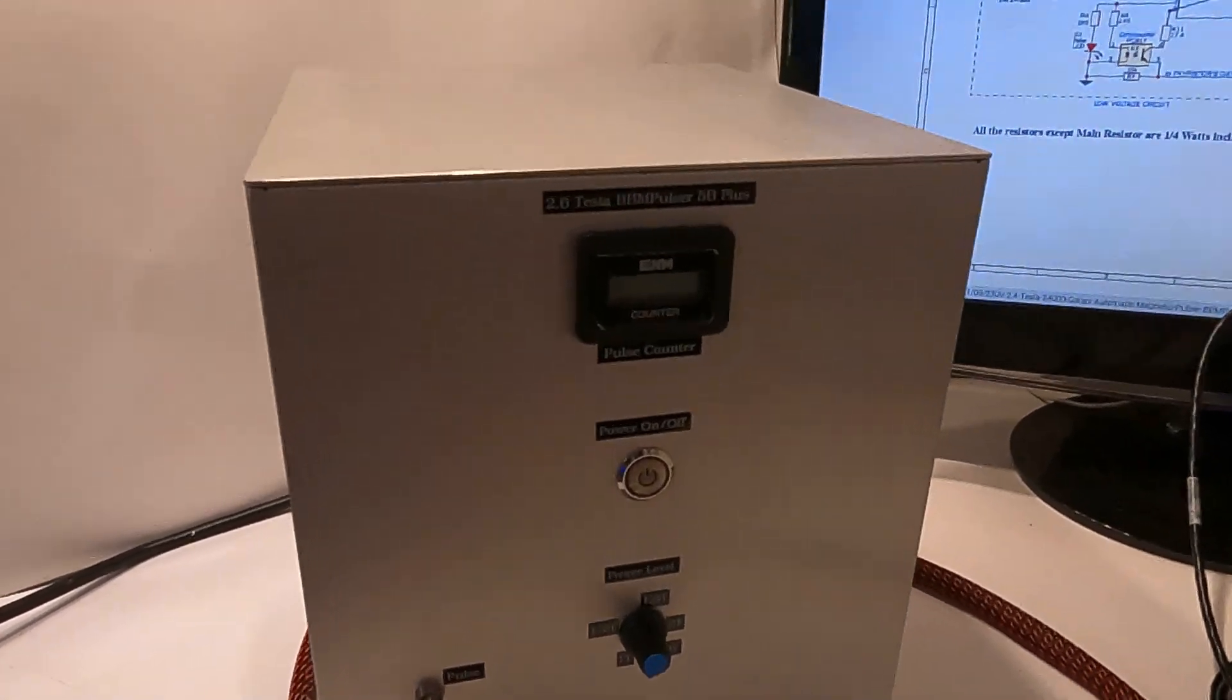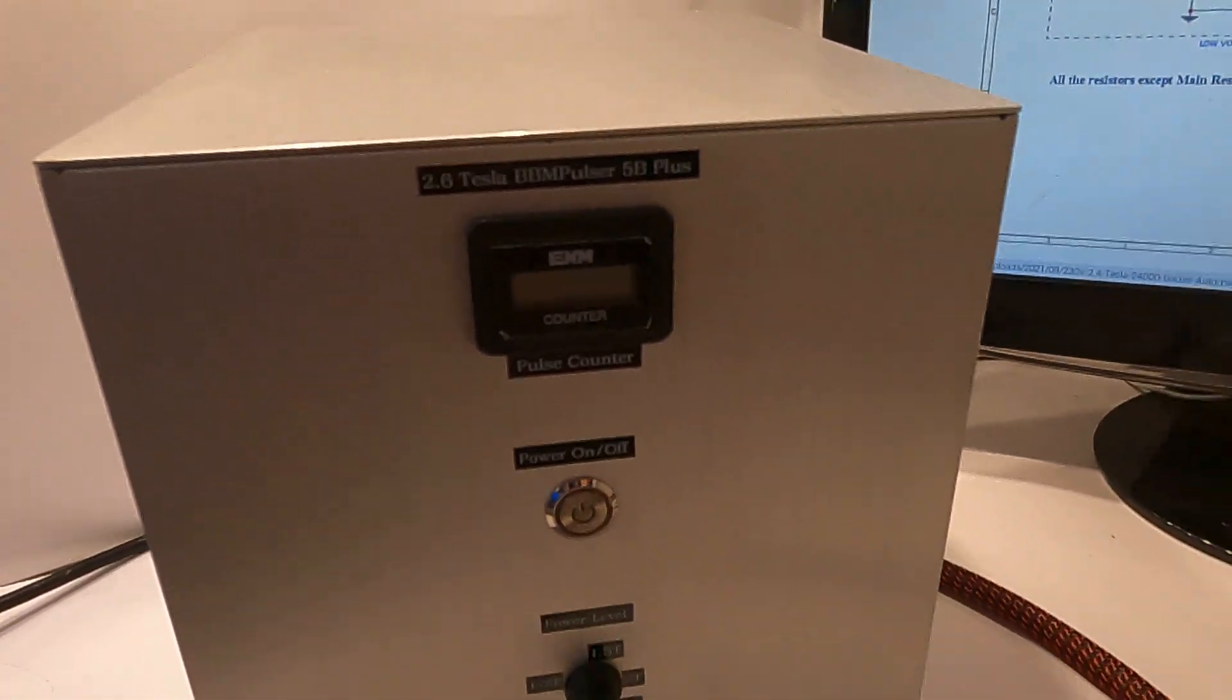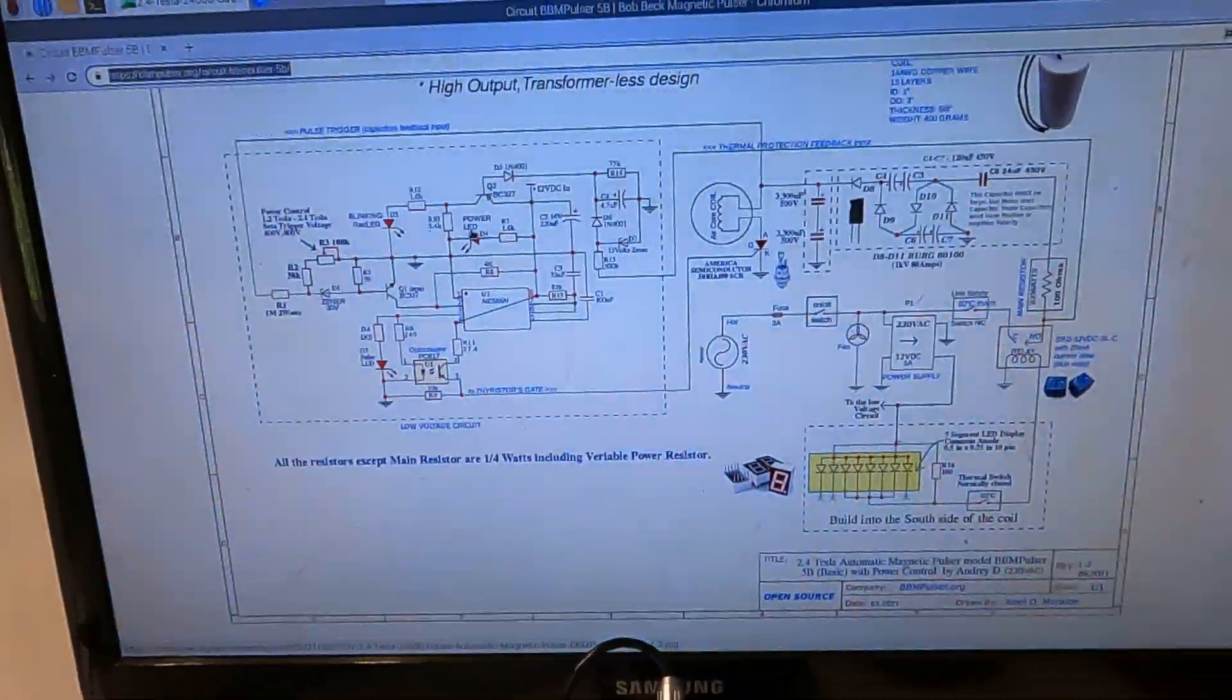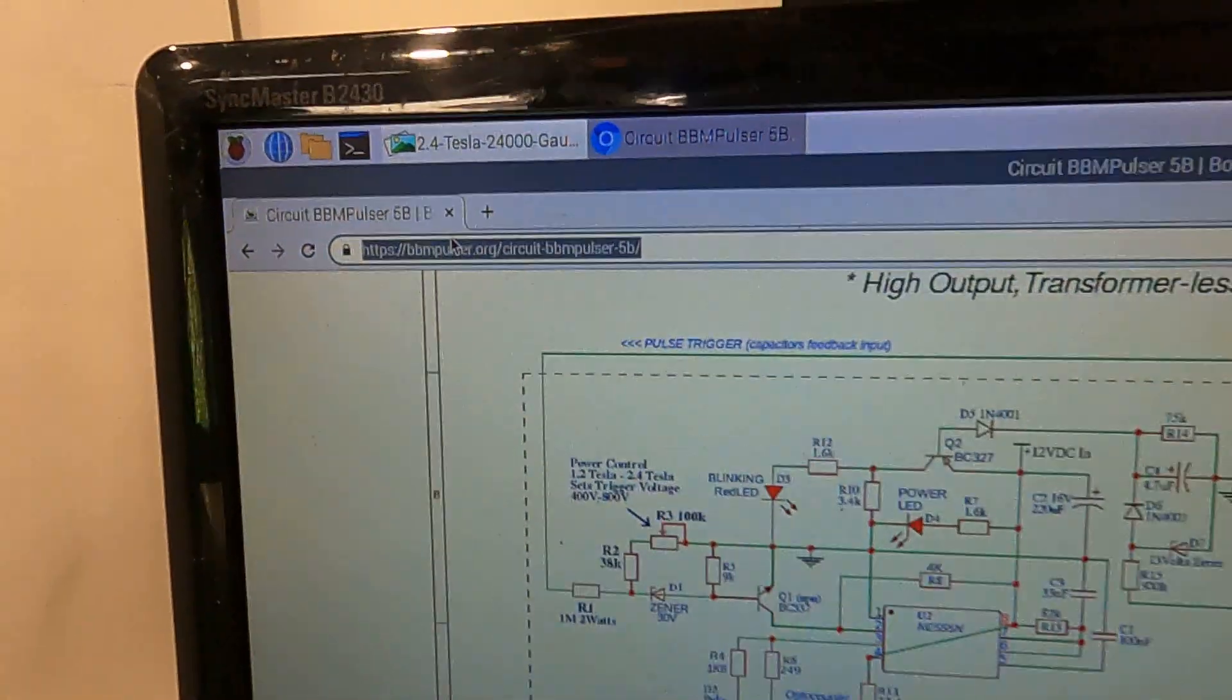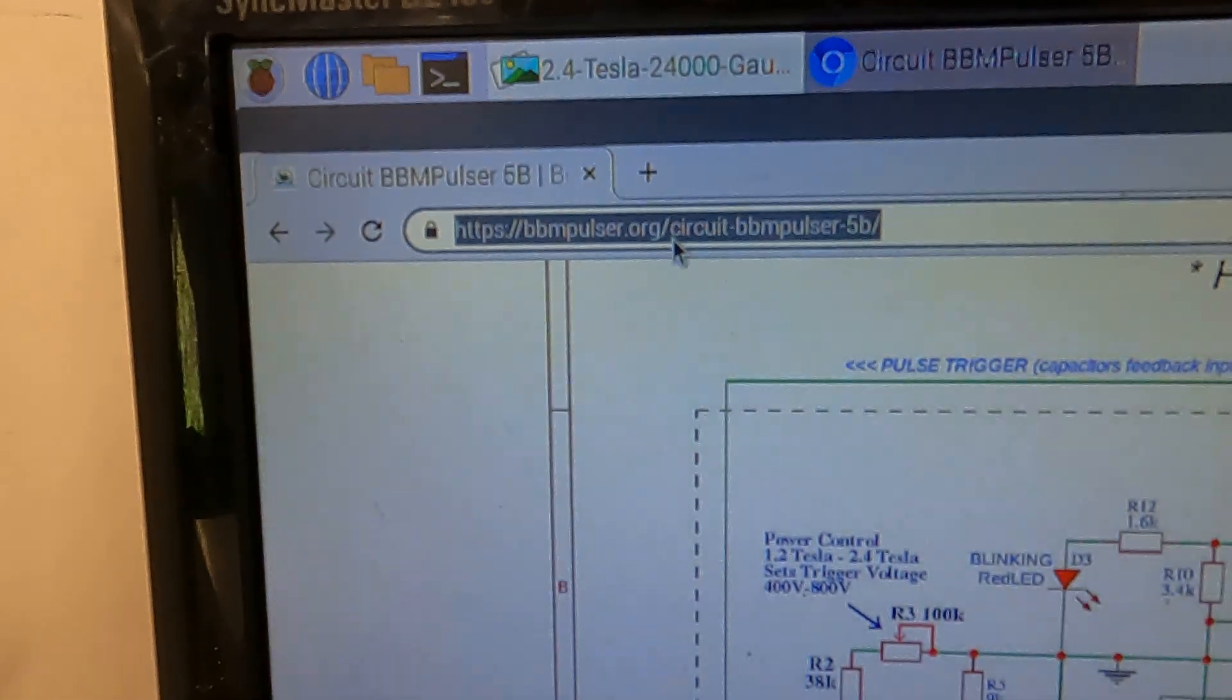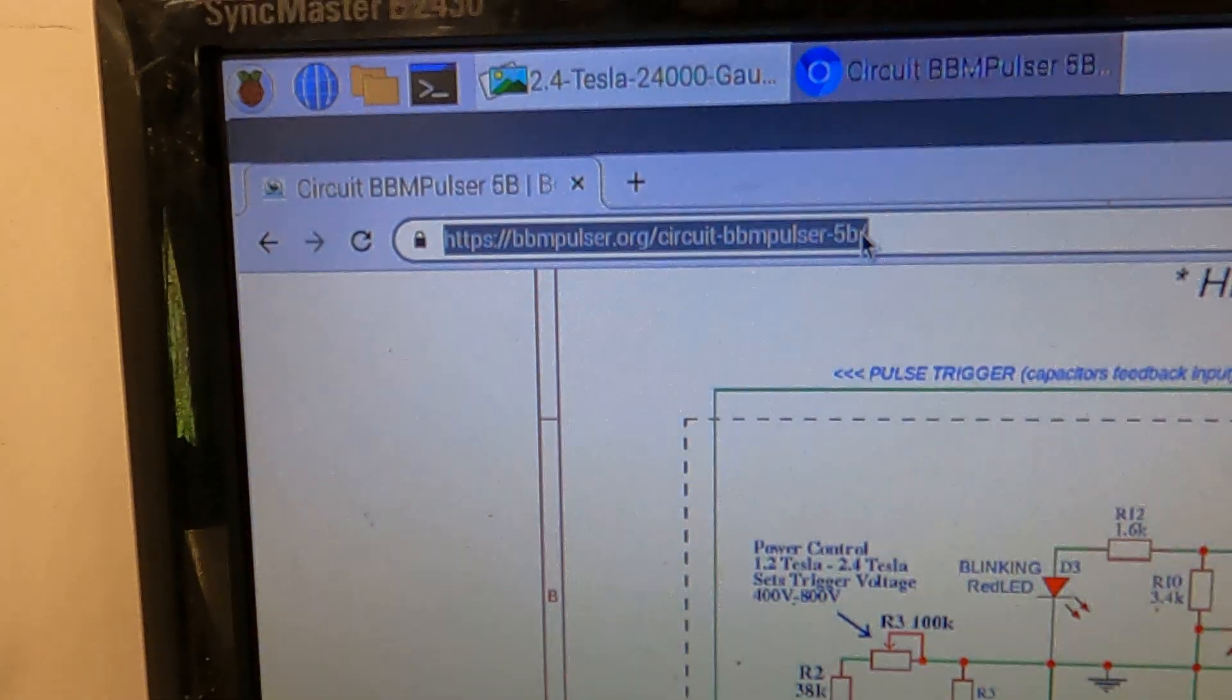I decided to call this BBM Pulsar 5B+. This is based on a 5B circuit, which you can find on my website at bbmpulsar.org. Select electronic circuits and then go to BBM Pulsar 5B.